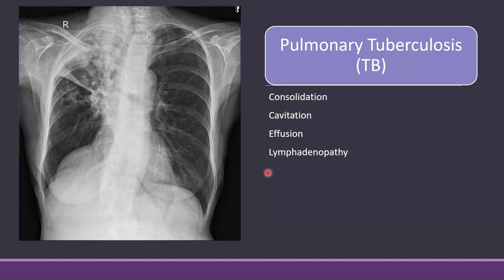If we have a close look at this x-ray, you can clearly see that there is an abnormal area here in the right upper zone. When we try to analyze this abnormality, you can see that this is a non-homogeneous opacification. Whenever there is a white abnormality we usually use the term opacification, especially when it is diffuse. We are saying non-homogeneous because there are certain areas of blackness inside this opacification.